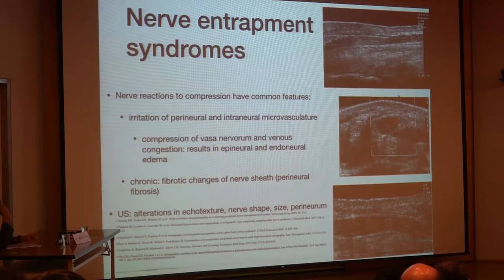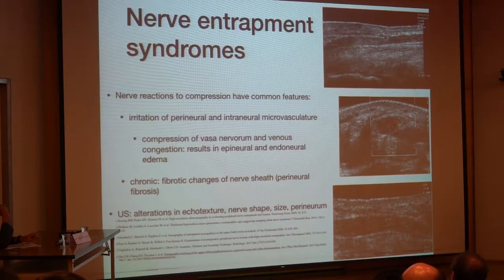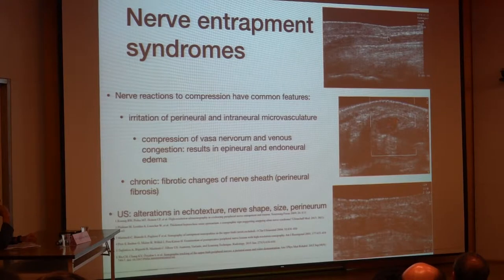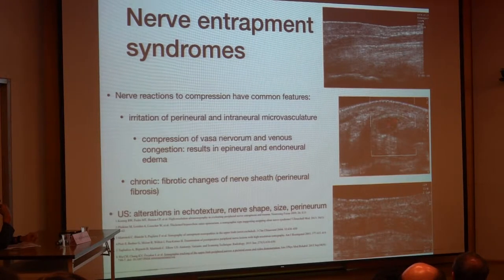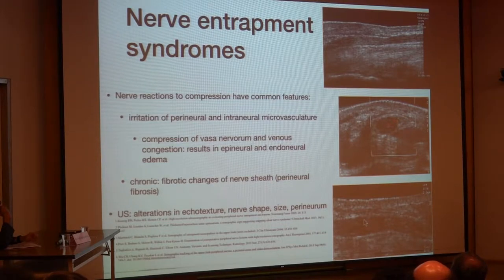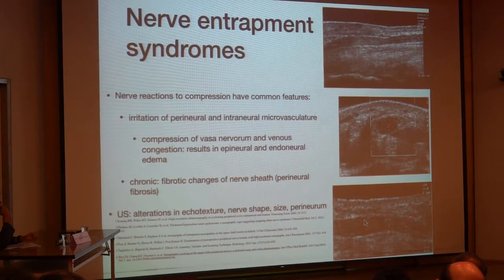In chronic stages, fibrotic changes cause increased echogenicity in the nerve. We can also see the level of the compression — this is the normal size, then there is the compression site, and then the swelling. Finally, there is also loss of the fascicular echotexture due to the edema.